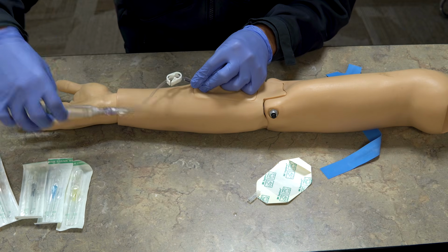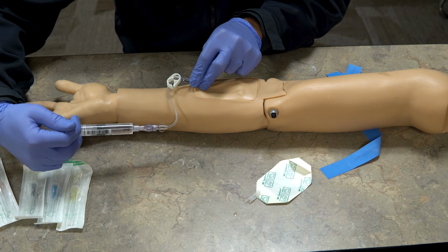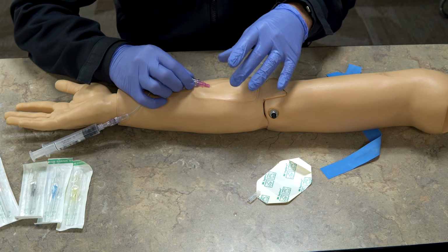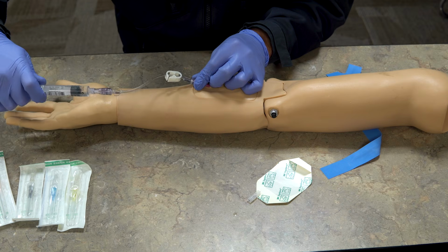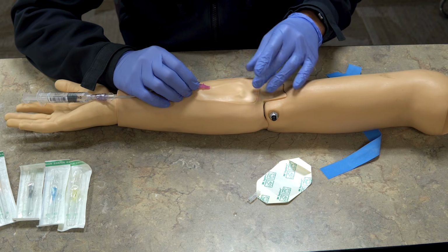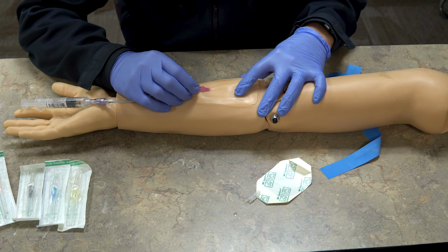Holding this still, I'm going to take this and flush. You can flush slowly, and as you flush, what you're looking for is the skin to start swelling up here. That means you've blown the vein, it's no good. You can try to withdraw some on this, and if you get blood back, that's a good sign. And that will tell you that you're in or not. If you've blown the vein, you just remove it, you're done. And you'll learn to recognize that as you go.